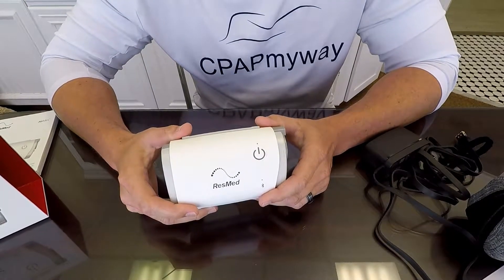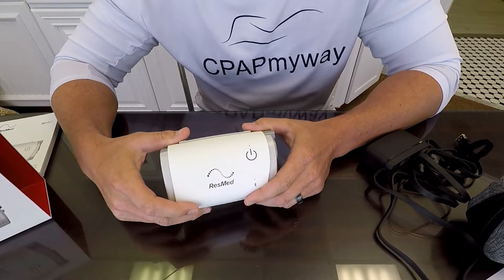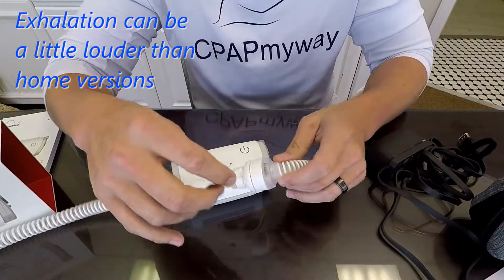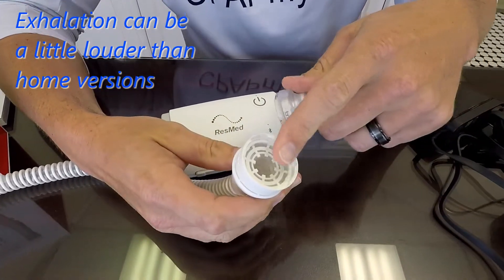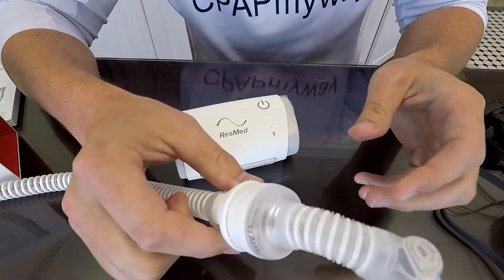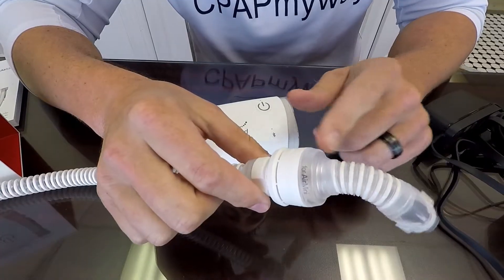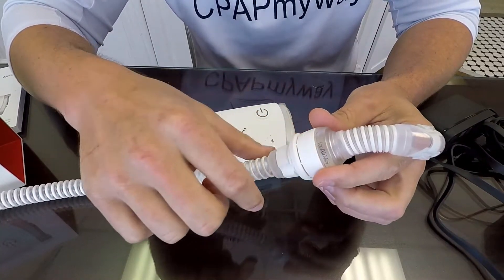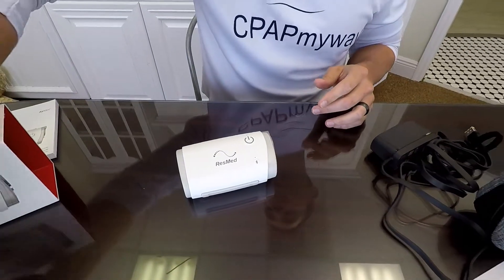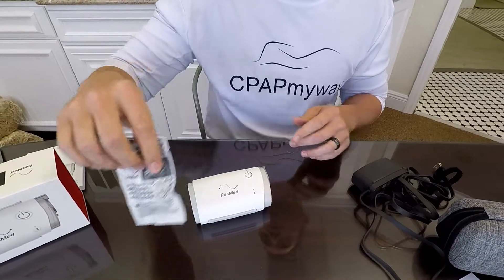One thing that's probably up for debate is that the exhalation is a little bit loud. You'll notice where the HME goes — we'll go over that when we install it — but we've heard that it can be a little noisy on exhalation, and you can hear your breath kind of going through that area. That's probably obvious because it's going through the little HME, so it's going to have some airflow noise there, but I haven't found it to be anything significant.